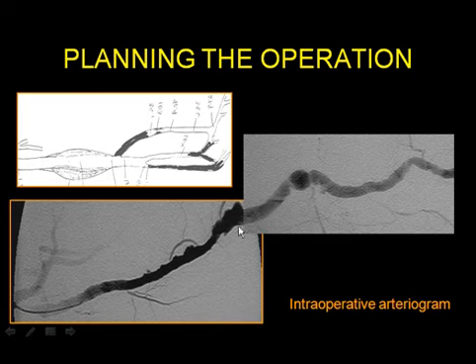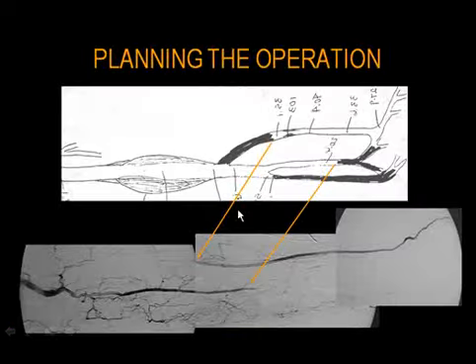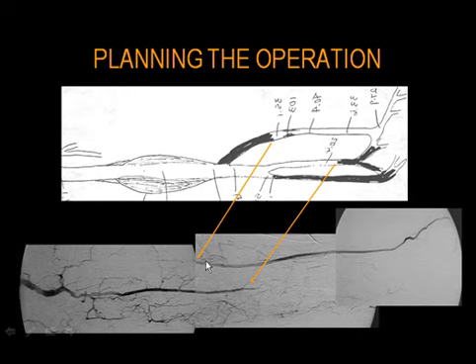As you can see here, the popliteal artery is a ragged-looking artery. Of course, you only see the lumen here in this patient with a lot of clot within the popliteal artery aneurysm. Distally, we can see that there is a patent anterior tibial artery, which correlates very nicely with the duplex scan. It's occluded at its origin. The peroneal artery is not visualized, it's occluded, and the posterior tibial artery is not seen.